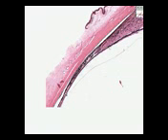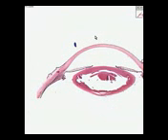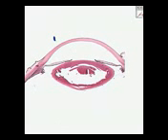We have a choroid, we have a sclera, we have connective tissue surrounding the sclera, we have bulbar conjunctiva, and really, backing into again our shotgun philosophy, I don't think there's any possible thing on this slide that you can't identify, because we have identified everything, and therefore you know what we're going to say here.